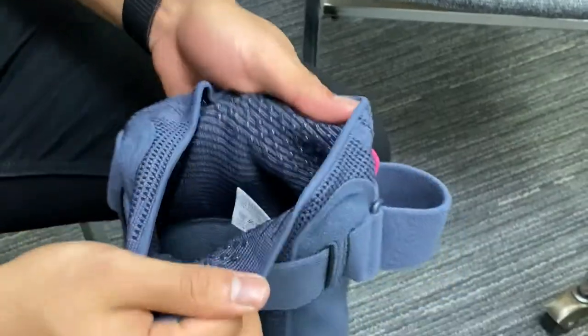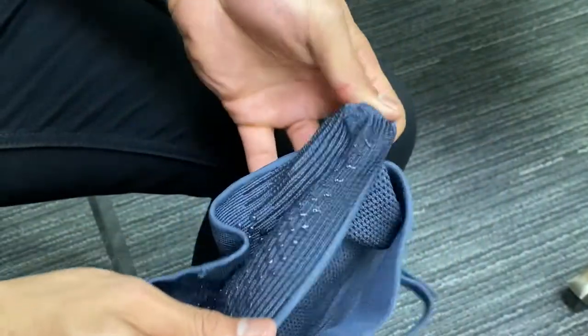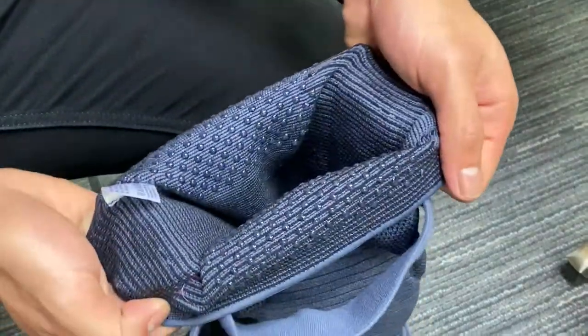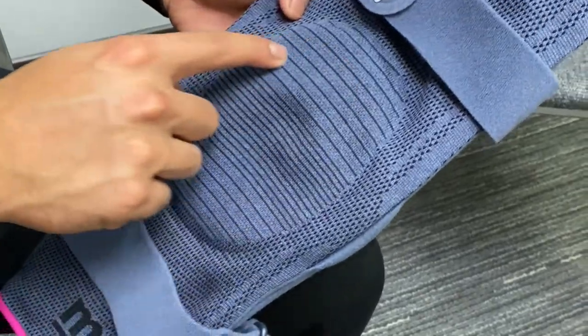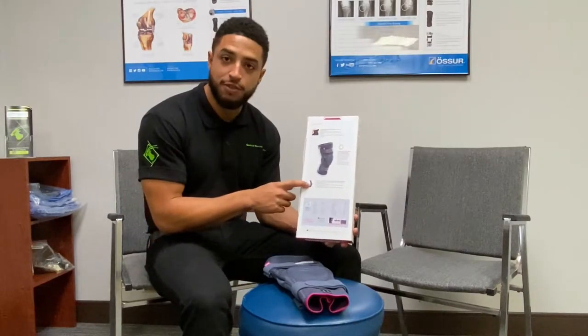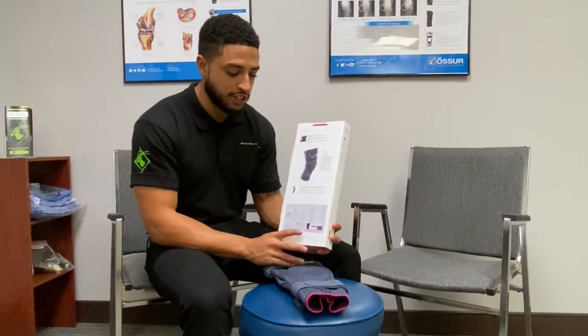You're going to see there's a silicone slip ring at the top of the brace — we'll be talking about that — which helps keep the brace from migrating on your leg. We have a silicone knee o-ring that keeps the brace positioned correctly. And we have the Physioglide Hinge. The hinges can be removed, so that's something we'll talk about.